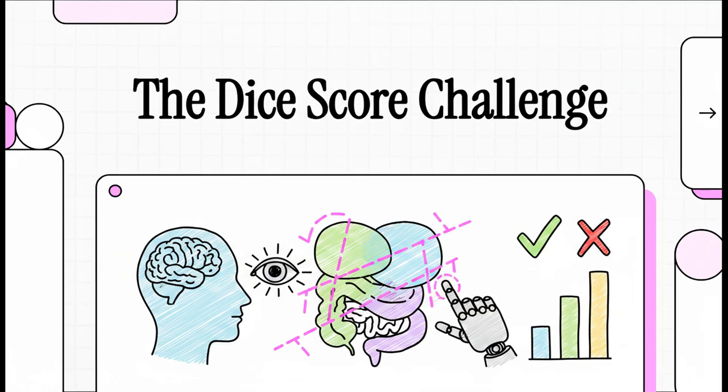You hear a lot about AI in medicine, right? But how do we actually know if an algorithm is any good? I mean, how do you grade a machine on something as complex as reading a medical scan? Well, today, that's exactly what we're going to do. We're putting an AI to the test, grading its performance against a trained human expert. Let's see how it stacks up.